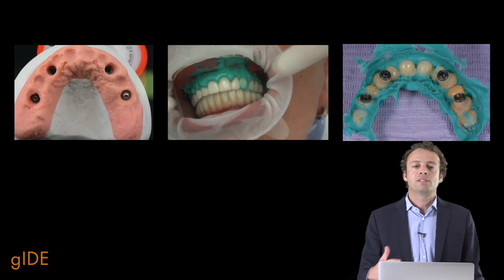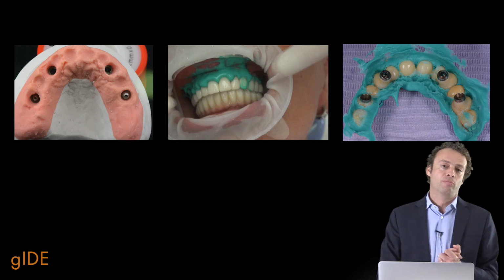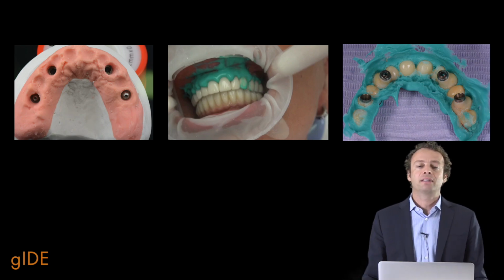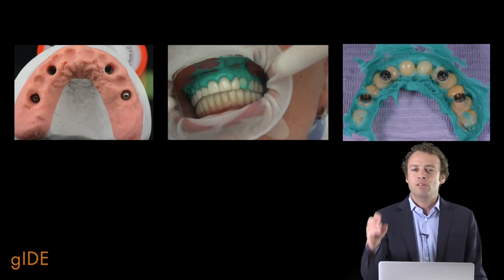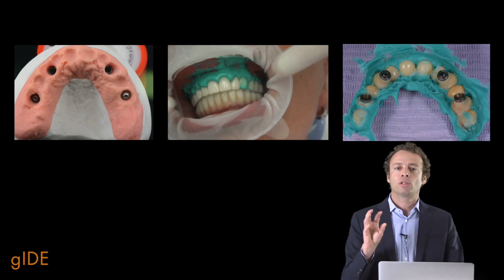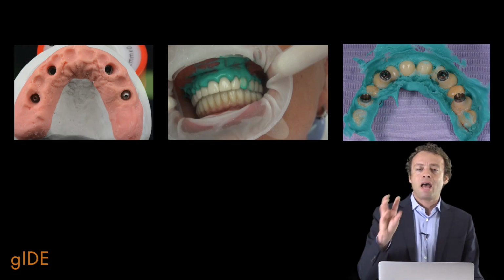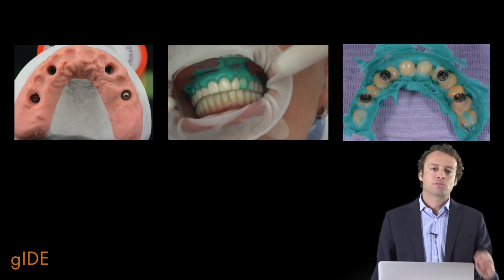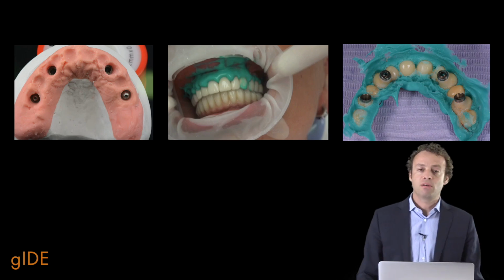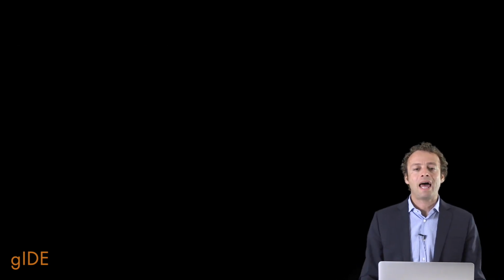And we can see that in some areas, in the pontic area, we don't have the material because we have an ideal compression. But in the other areas, we can see how we have some material, we have some spaces. And so it is exactly what we need in order to have an ideal soft tissue reconstruction. So now I place the healing abutment in the mouth of the patient and I ask the patient to wait 15 minutes in the office.